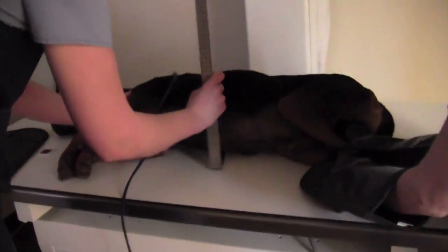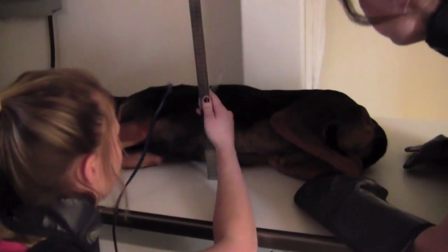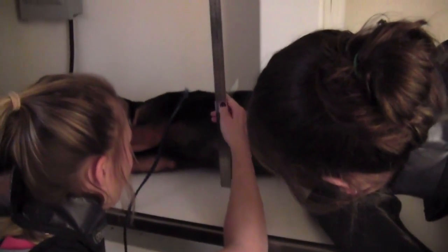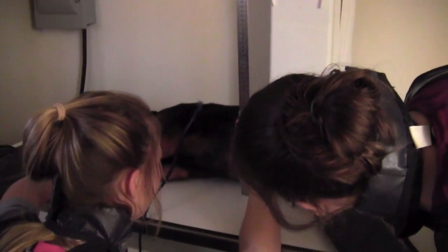When taking abdominal x-rays, it can sometimes be suggested that the patient be fasted for 12 hours before, or given an enema 3 to 4 hours prior to the x-ray, or even have the bladder emptied.